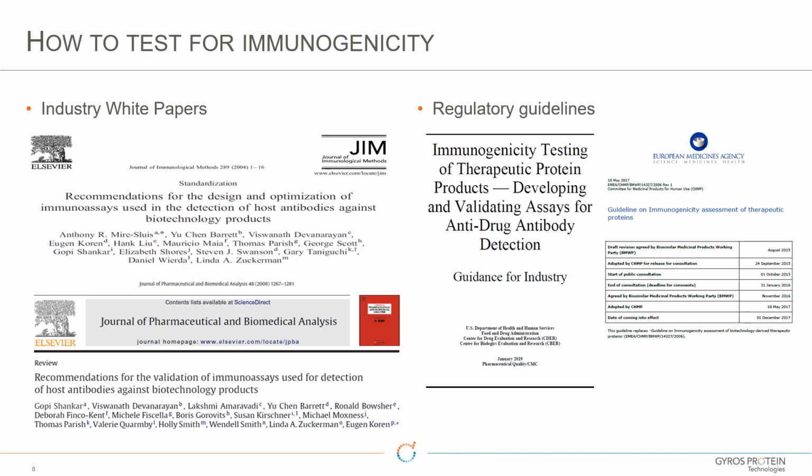But this level all depends on the positive control you use. Yeah, if you use different positive controls, you'll get different sensitivity values. So it's important to select the positive control which is the most relevant for clinical. Right. Oftentimes you'll see somebody using a monoclonal positive control, which is not the same as the polyclonal response that you're going to get in the clinical population. No. But monoclonal, from a reagent management perspective, is easier to use and include over a long period.